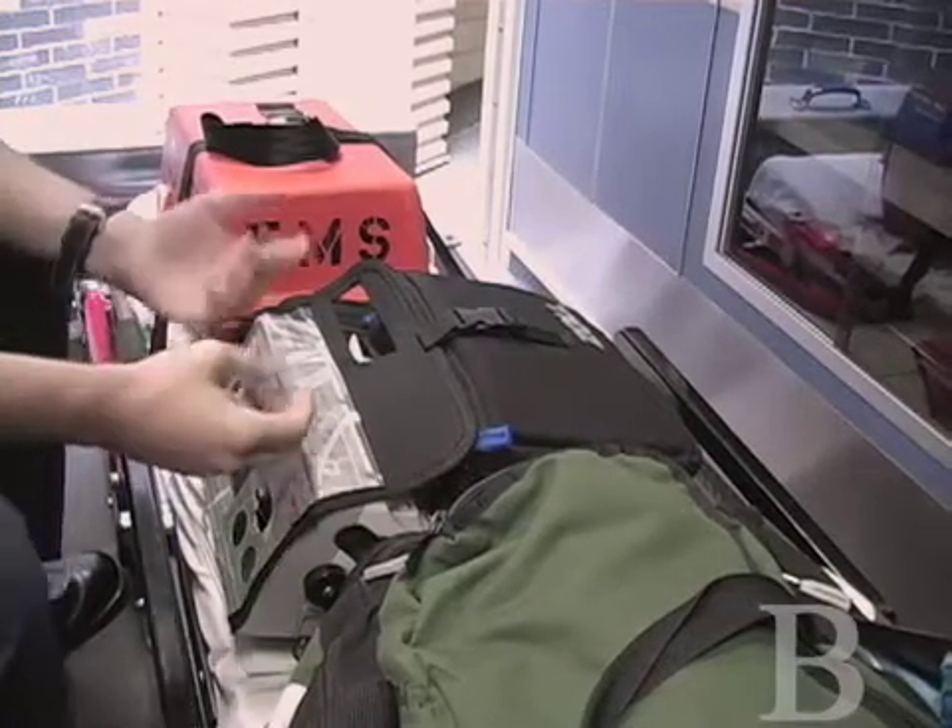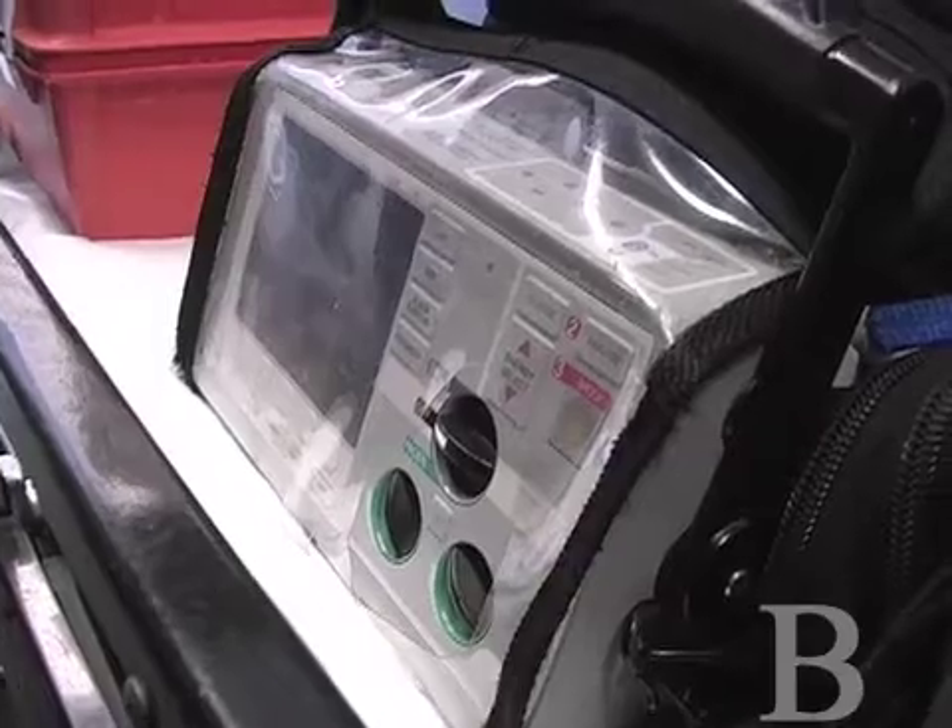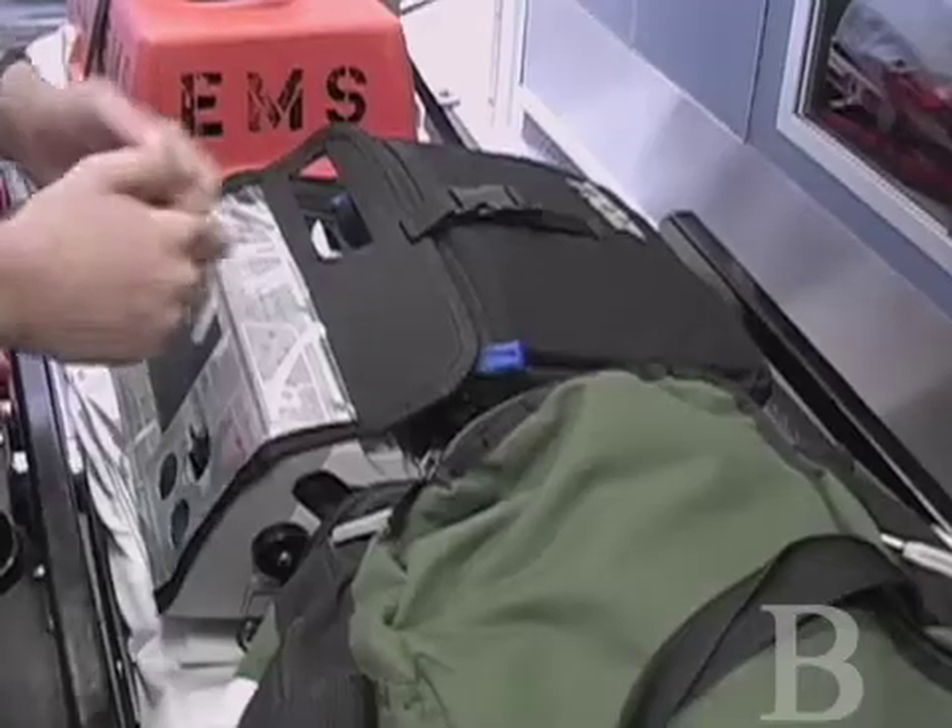Coming down here, we have our defibrillator, where we can slap the pads onto a patient who's in full arrest and shock him back.